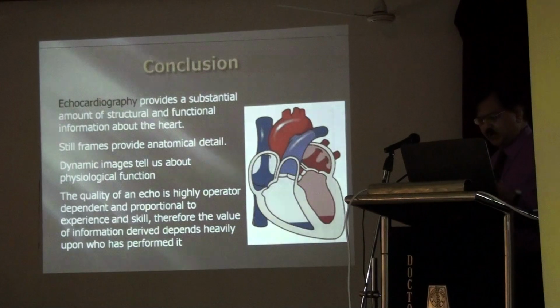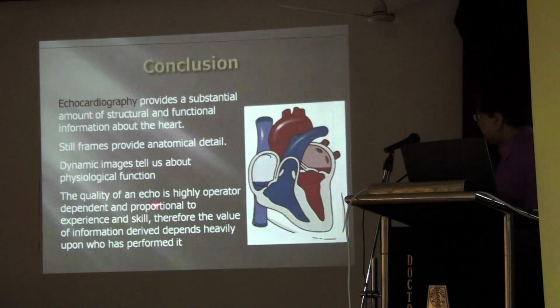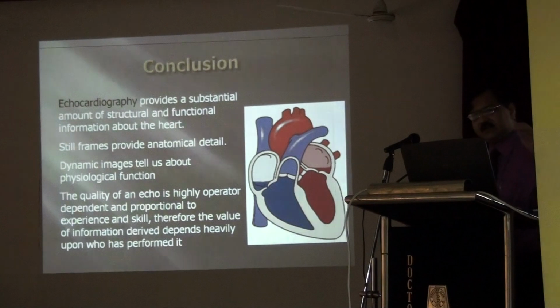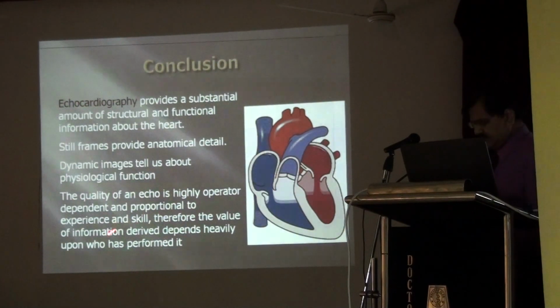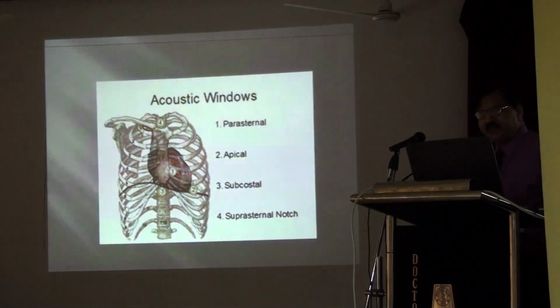So we have to concentrate very much on whether it is normal or abnormal. What are the normal pitfalls? What is the differential imaging diagnosis? What are the clinical features of the patient? And then finally we have to give the report. So this is the important part of the basics. Some pictures are moving, still pictures have been brought in, these four.